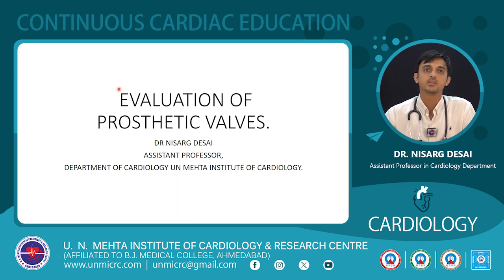This topic will be discussed under the headings regarding what are the types of valves, then how do you assess it, starting from clinical, then various modalities of investigation including echo, CT, and how to go about various pathologies of the prosthetic heart valves, namely the most commonly found during evaluation is whether the patient has patient-prosthetic mismatch, or whether the patient has prosthetic heart valve thrombus, or is there any pathological regurgitation, and other pathologies like infective endocarditis involving the prosthetic valves, so on and so forth.